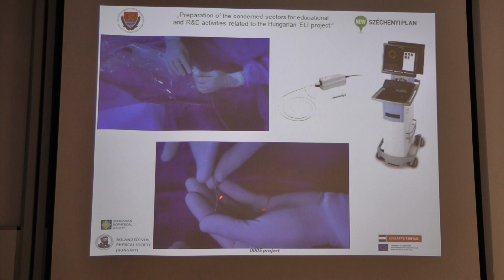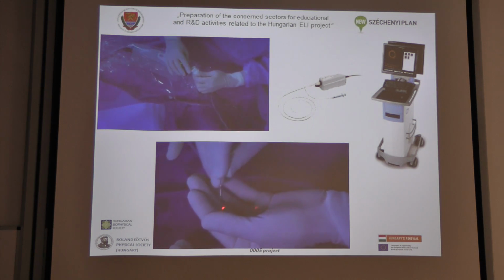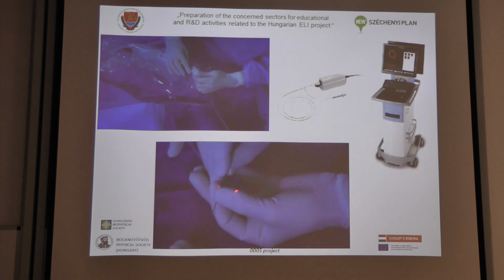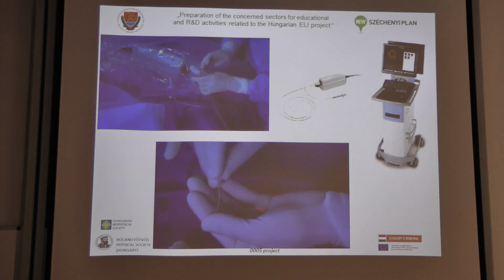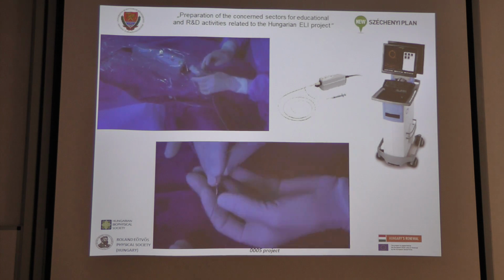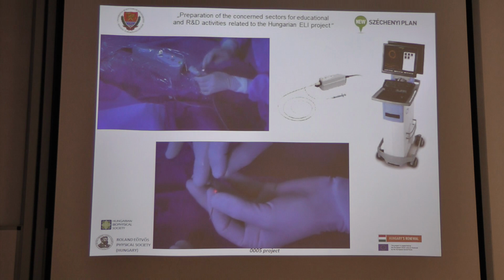And this is a wire on which we reel these catheters, and this wire goes down to the very distal part of the coronary artery, and this will track down any kind of catheter we use. So you will see that first the guiding catheter gets into place in the proximal part of the coronary artery, then this very tiny wire. Can you see it? I don't know. And we can reel down any device, any kind of little instrument we use for this percutaneous coronary intervention.